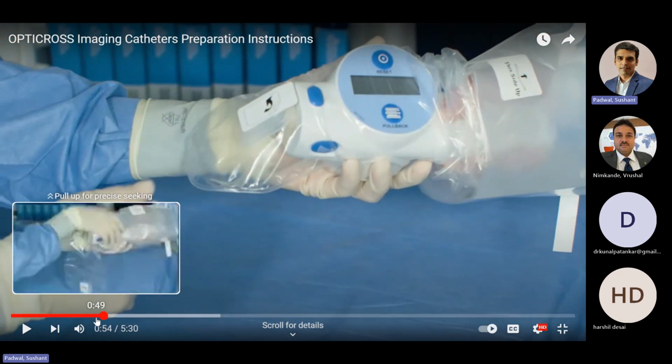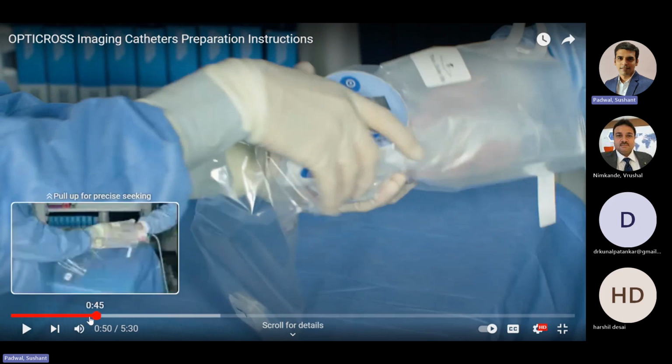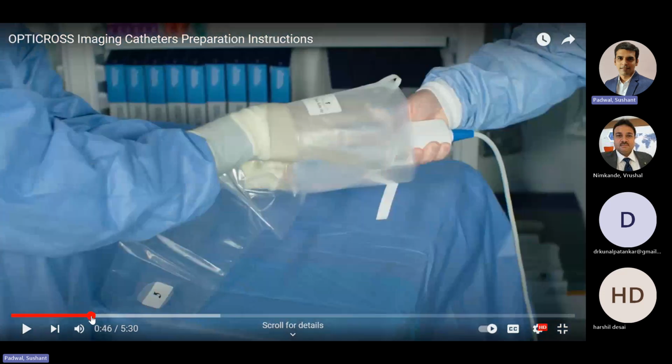So here I just wanted to pause it and show it to you once again. Whenever we are bagging the MDU, usually the non-sterile operator hands over the MDU5 to the sterile operator, leaves it, and just pulls the plastic bag behind. But what we can do to make it quicker and easier, it will take hardly 10 seconds to bag the MDU as well as connect the connector properly.